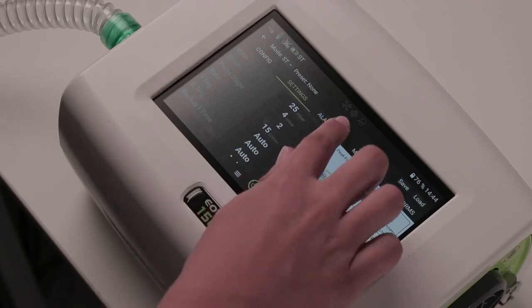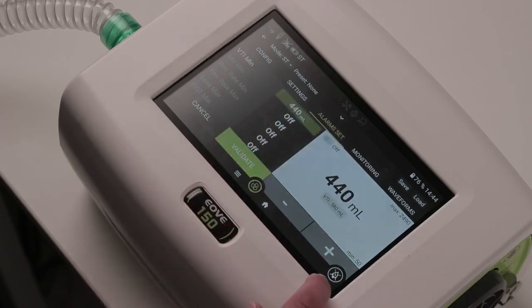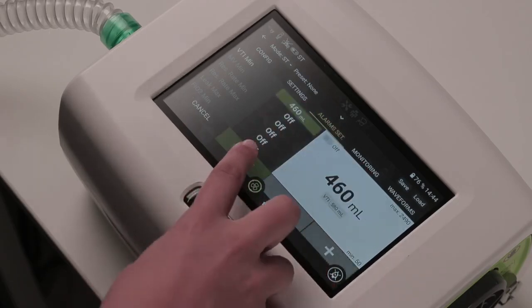From the alarms tab, you can set the alarm thresholds during the ventilation. For that, select the alarm to modify, adjust it, and validate.